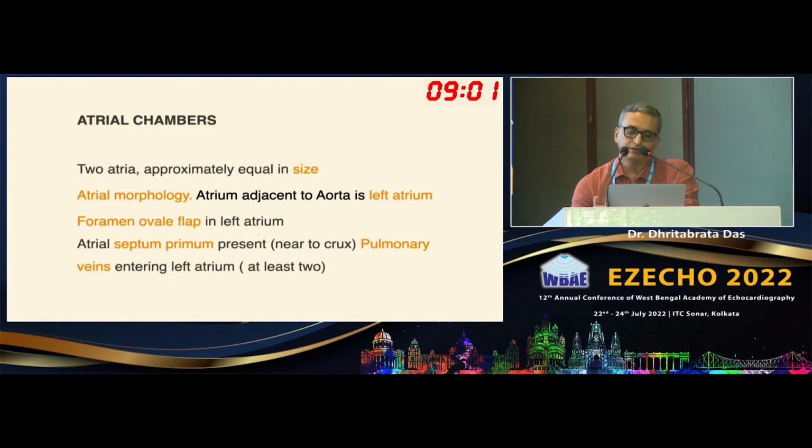patent foramen ovale is open and the flow is from right to left. So the flap should be opening into the left side of the atrium, and atrial septum primum is present, and pulmonary veins are entering into the left atrium, one should ensure.